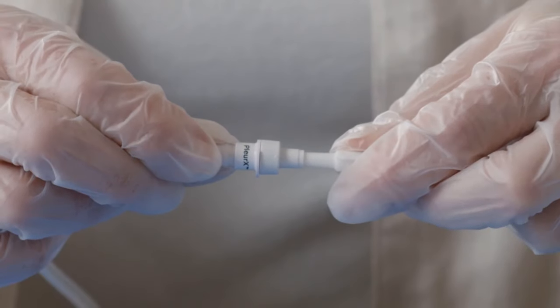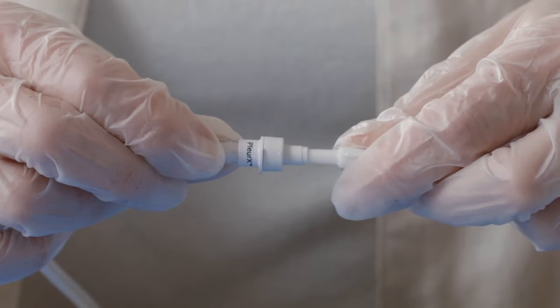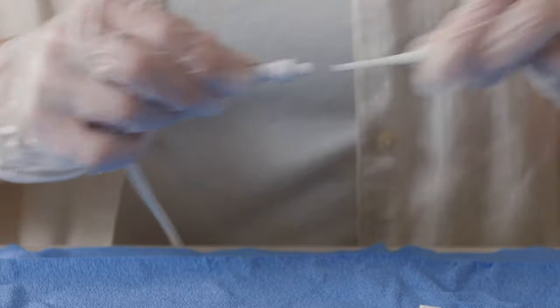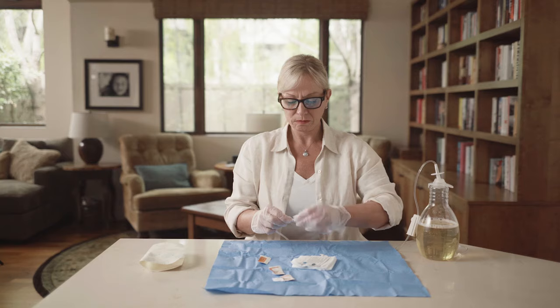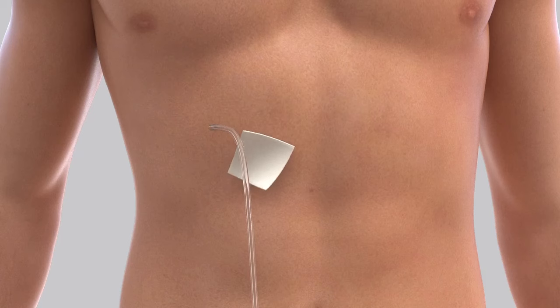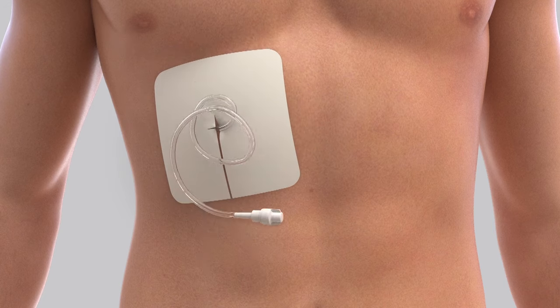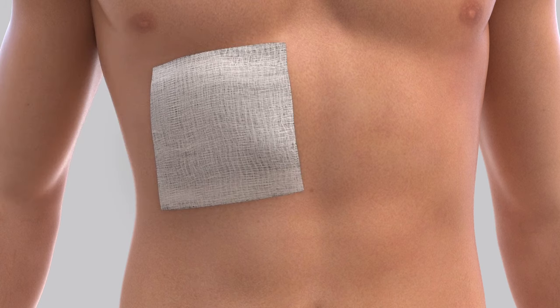When drainage is complete, disconnect the drainage bottle from the catheter by holding the drainage line near the access tip and the catheter near the end, then pull the access tip out of the catheter. Clean around the opening of the catheter using a new alcohol pad and twist the new cap into place until you feel a slight click as the cap locks. Clean the skin around the catheter site using the last alcohol pad. Place the foam pad around the catheter. Wind the catheter in loops and hold it on top of the foam pad, then place the gauze pads over the catheter.